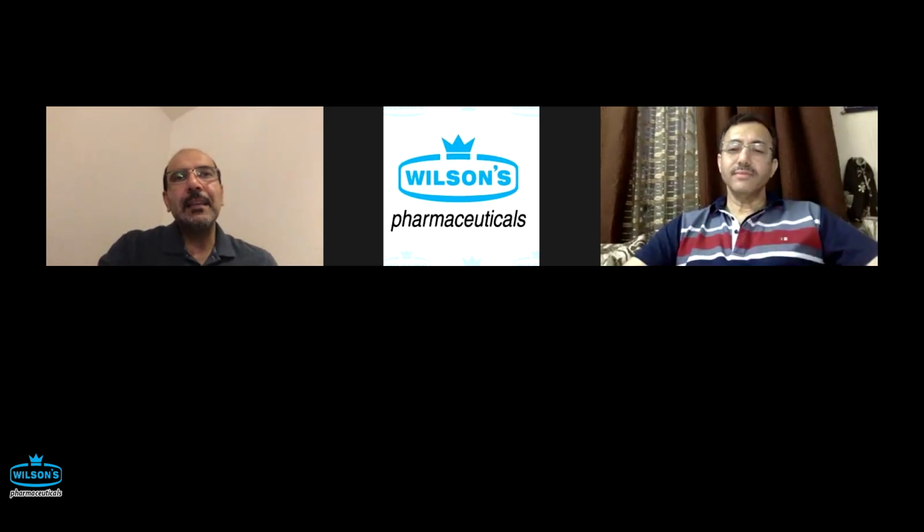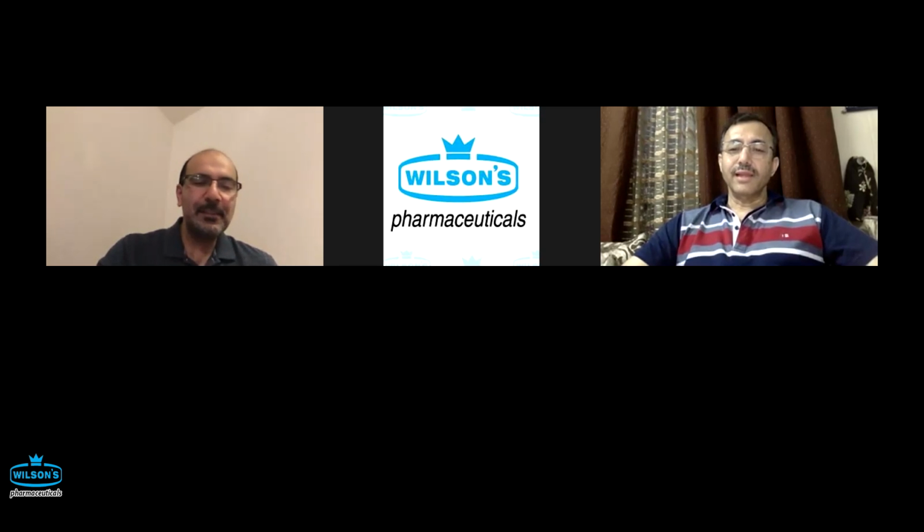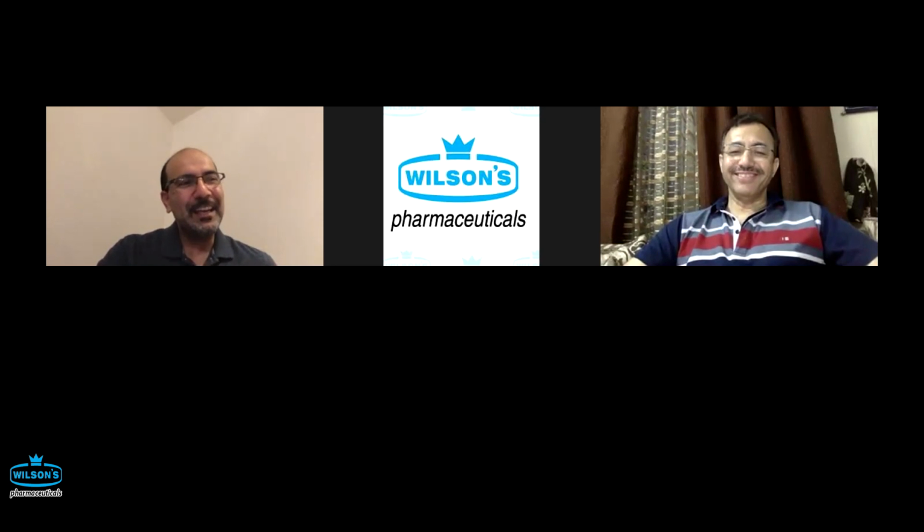So I think getting to those levels of competency, FNA yield should be 90% plus, and diagnostic wise, basically high 90s in terms of being able to visualize pancreas, bile duct, etc. Unless of course there's some altered anatomy. So I hope that kind of answers your question, but in short, it's not for everybody. It's okay if you don't do it. And thirdly, it does require a lot of sustained practice, and it's the right thing to do it for the patients.